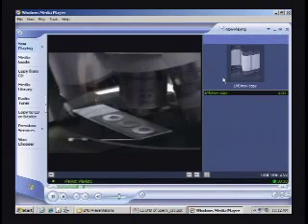This is a homemade video, and I'm sorry if it's hard to see. You'll see it in action in the room. This is actually the microscope objective right here. It doesn't come out well with the dark, but there's the microscope objective. And then you'll see that there's the slide on the stage. You'll see those circles. We're going to be putting those circles on there. That was just so I knew where my spot was. And the laser comes down through the objective and actually cuts through here.